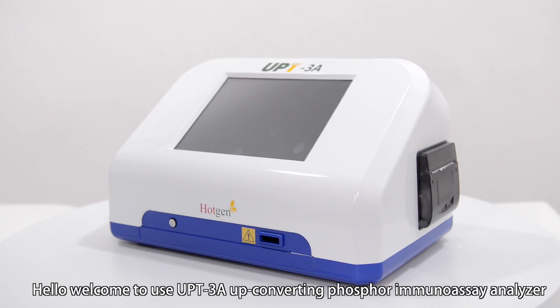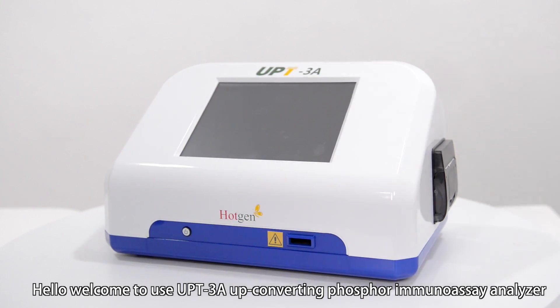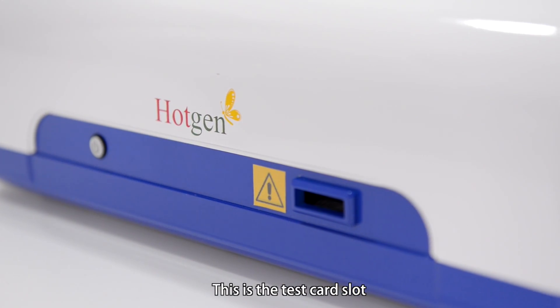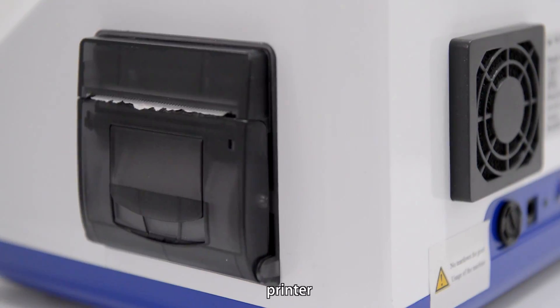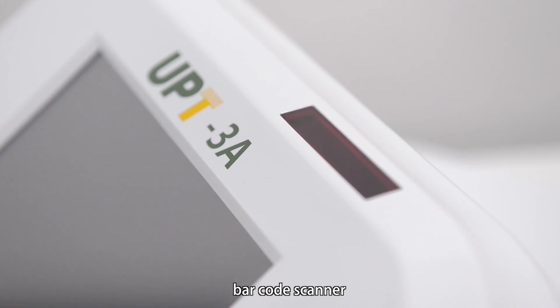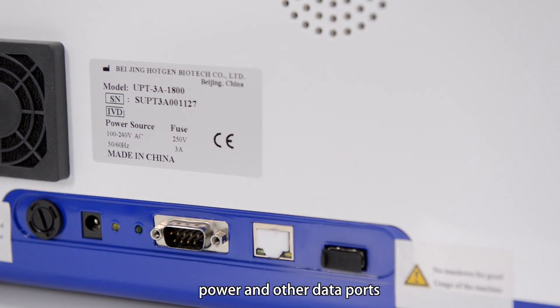Hello, welcome to use UPT3A Up Converting Phosphor Immunoassay Analyzer. This is the test card slot, power switch, printer, barcode scanner, power and other data ports.